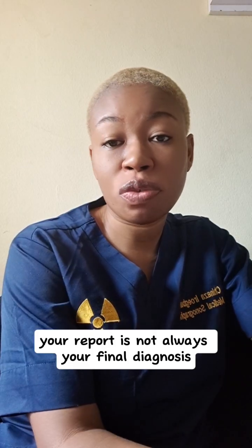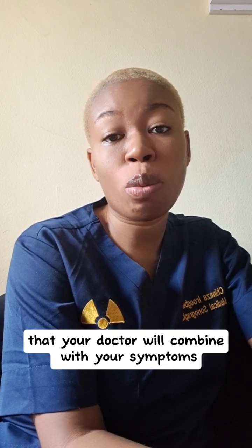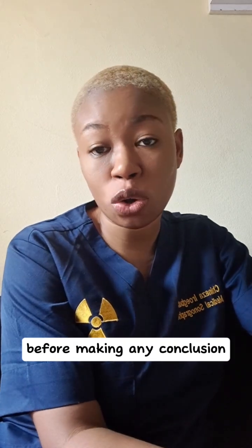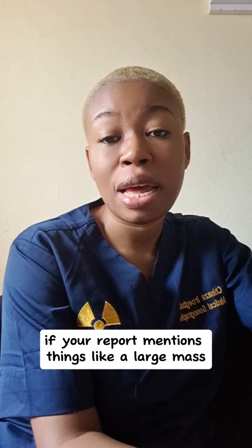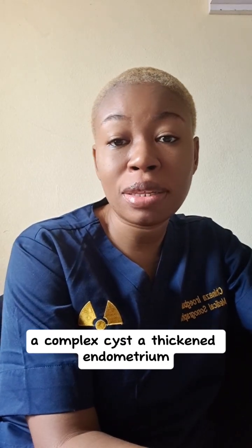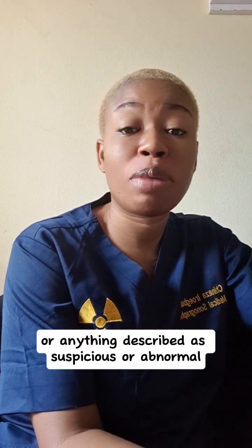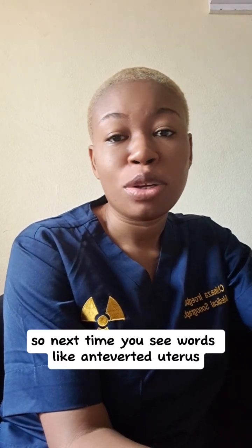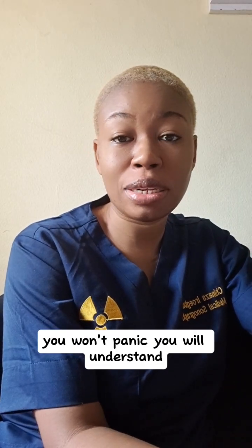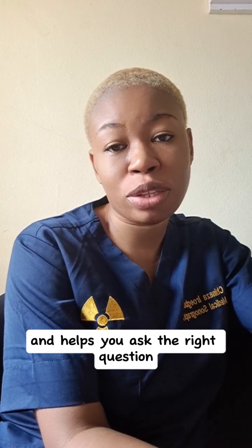Now, this part is very important. Your report is not always your final diagnosis. It is part of the medical interpretation that your doctor will combine with your symptoms before making any conclusion. You should make sure to follow up with your doctor if your report mentions things like a large mass, a complex cyst, a thickened endometrium, especially after menopause, or anything described as suspicious or abnormal. So next time you see words like anteverted, uterus, POD, adnexa, you won't panic, you will understand. Understanding your report puts you in control of your health and helps you ask the right question.